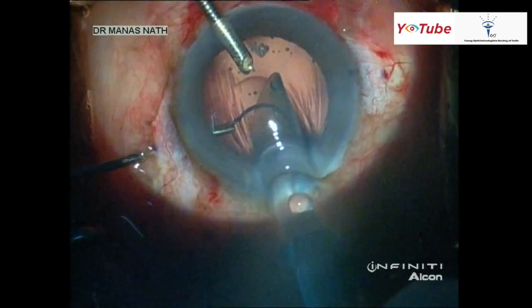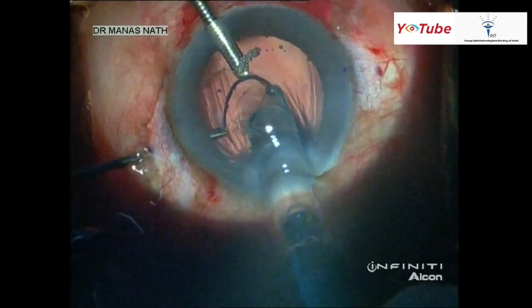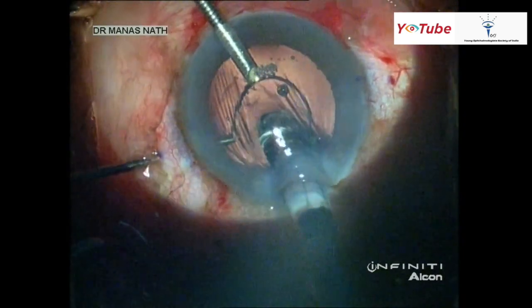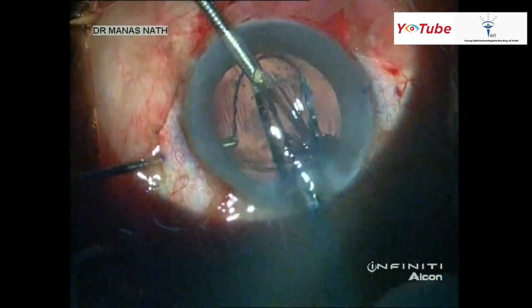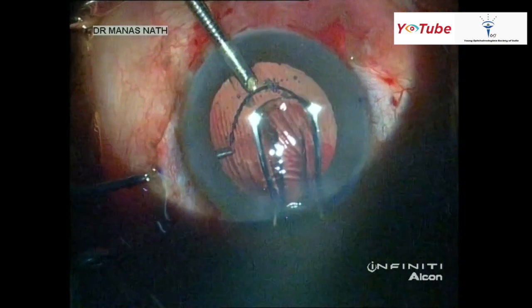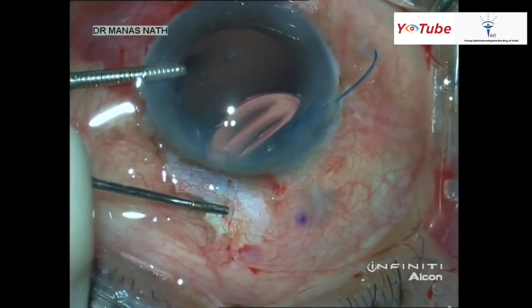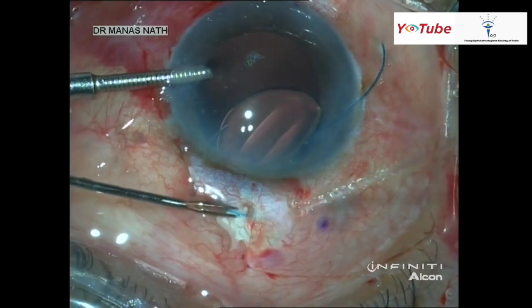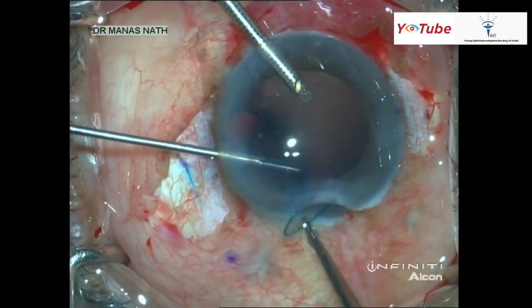We should tell our assisting staff to unscrew the lens injector and wait until the whole lens is delivered into the anterior chamber. It will come out gradually — we need not worry, because the trailing haptic will be out of the tunnel anyway. We then take the leading haptic to the sclerotomy and tuck it inside the scleral tunnel.